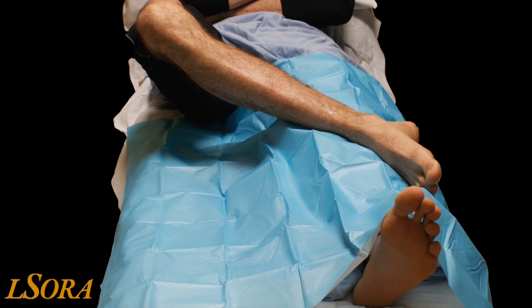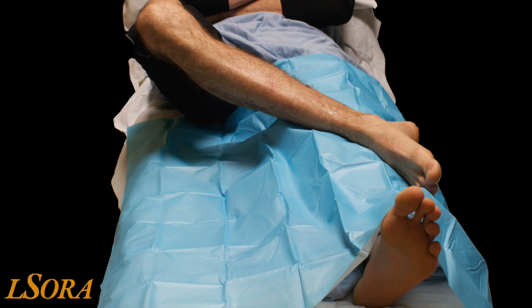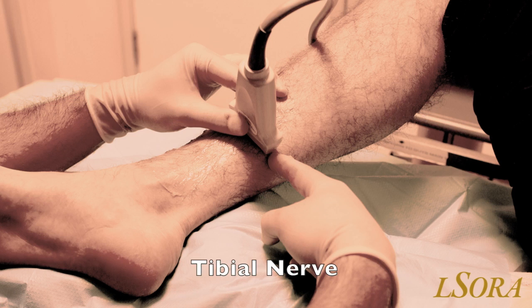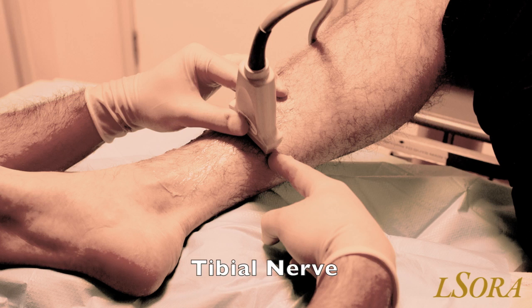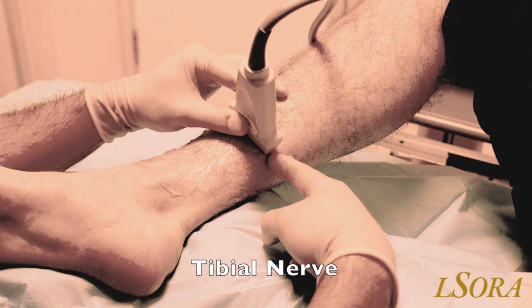We begin our blocks with the patient's leg in the figure of 4 position. We begin by starting with the tibial nerve, the largest of the 5 nerves.